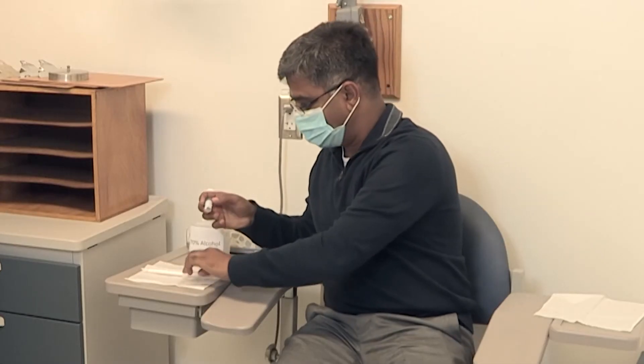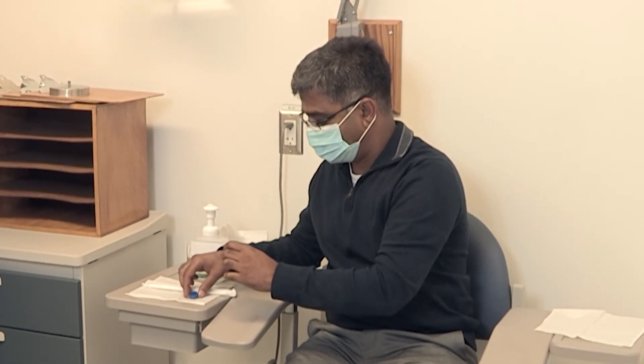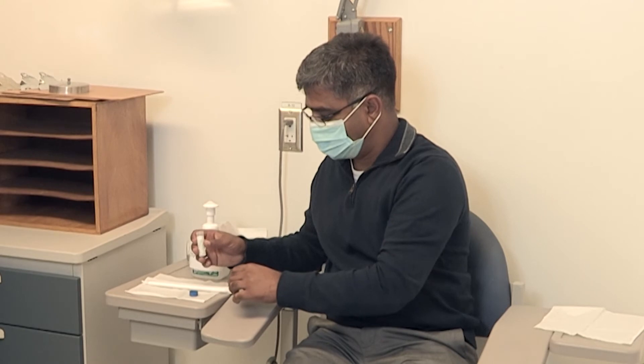Unscrew the cap of the tube or container in the supplied kit. Place the cap upside down in a clean, secure spot. It will be used to seal the sample.